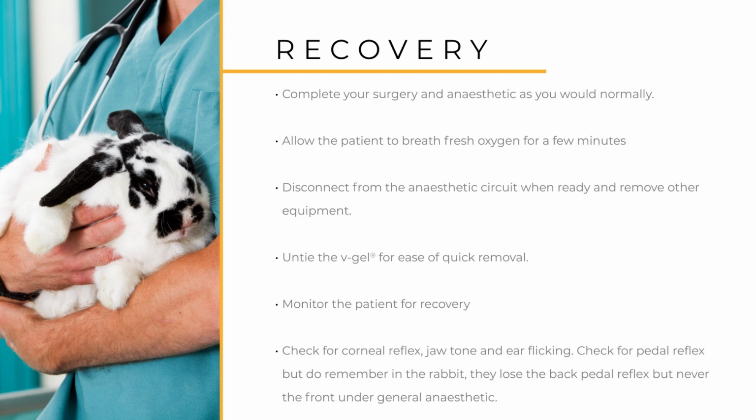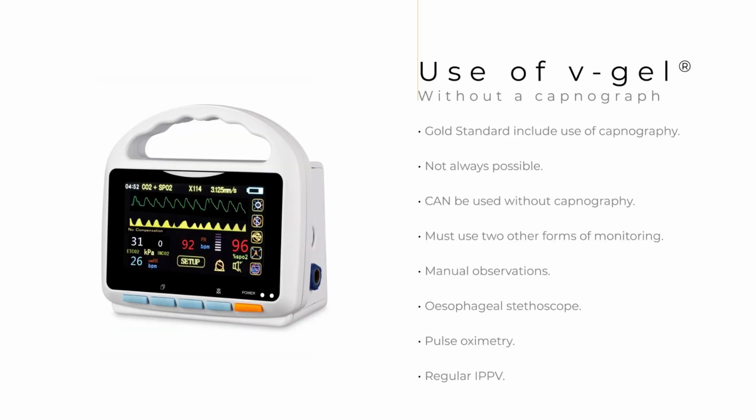Give additional oxygen if required by face mask. It's important to get your patients to eat as soon as possible, and as there will be no discomfort felt, they will be much more likely to eat straight away. Equally, oral medications can be prescribed, as the patient will not be experiencing the same discomforts felt with the use of an ET tube.